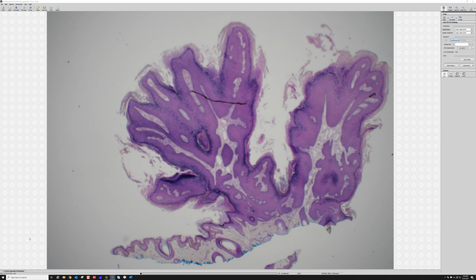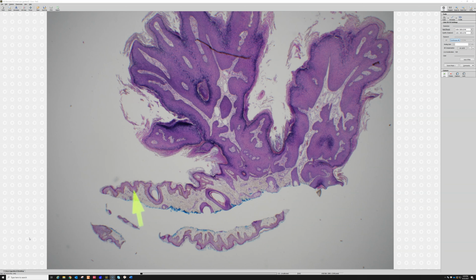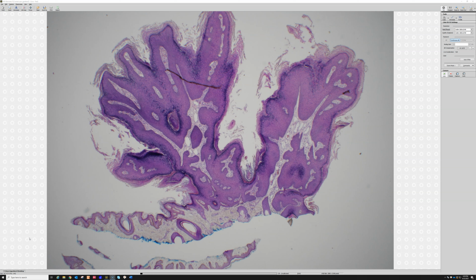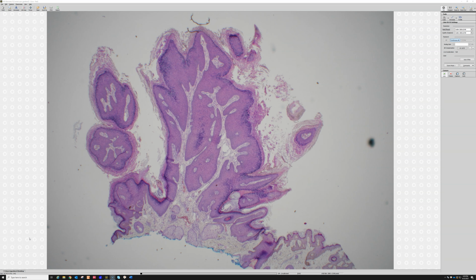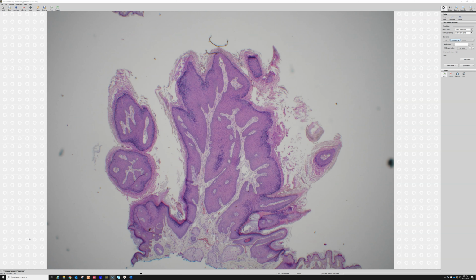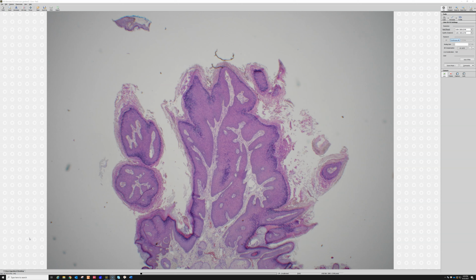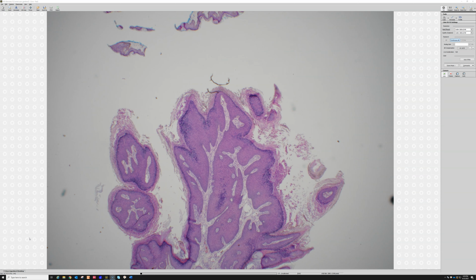Now look at this. Here's the skin surface way down here, and we've got this massive tree of a wart blossoming out, growing and sprouting out of the skin, pushing way up. So really a polypoid sort of wart. And sometimes these can have really thin, elongated papillae that stick way up from the surface, particularly on the upper cheek or near the eyelids.